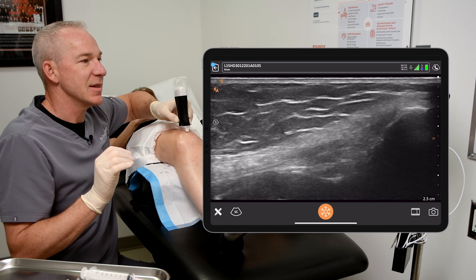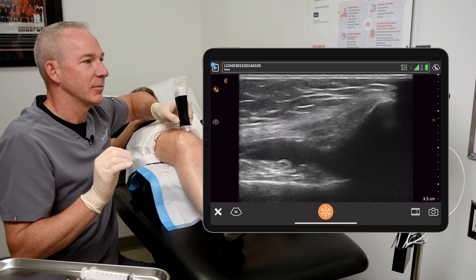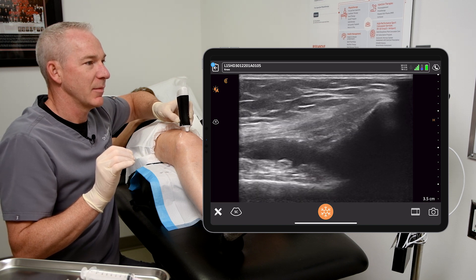With Clarius, we can go almost hands-free. I've got the probe in my left hand, I've got the needle in the right hand, and if I've got a sterile glove on each, how on earth am I supposed to change the settings on the ultrasound machine? I simply activate the voice recognition software and ask for increased gain, increased depth, or to capture a movie — and it does it. That means I don't have to break my sterile field by reaching out across the patient and leaning, maybe brushing my clothing against the injection site. Voice recognition is an absolute must going forward in ultrasound.